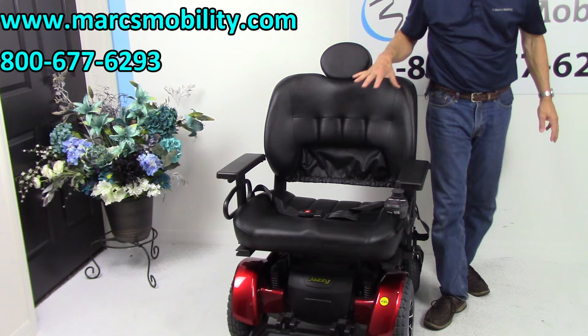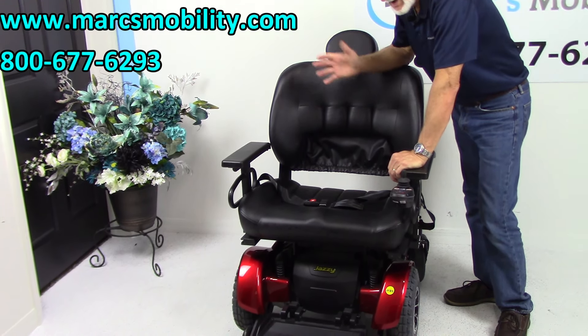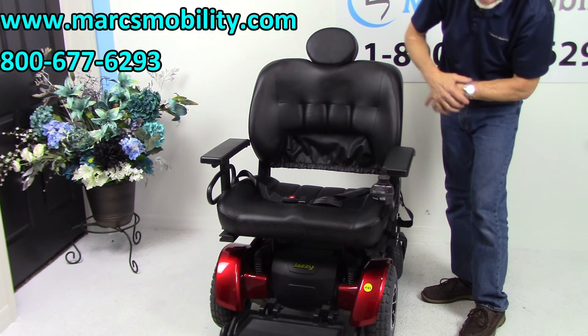There's nothing we can do about this seat — we're not going to change it, and we cannot make the arms smaller or put in a smaller seat. Whoever buys this chair will be getting it exactly as demonstrated here today.